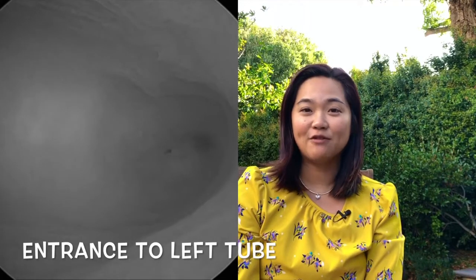Now the camera is inserted into the cervix and water is constantly pumping through the uterus to try and open up the cavity so that we can see more clearly. And this explains that current that you see. Now if you look over this way, that hole is the entrance leading into the left fallopian tube. And we're going to look at the other side now, look at the right fallopian tube.